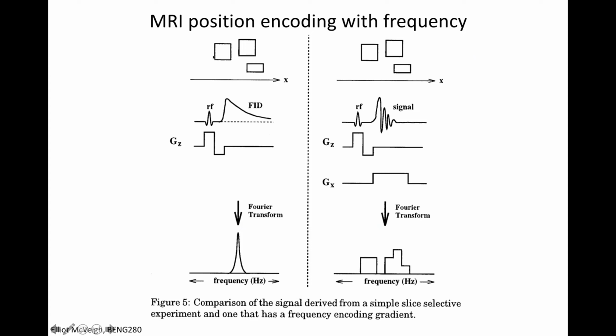And this is straight out of that little 20-page write-up for the Introduction to MRI for Engineers that's in the modules section. So you can go back and read the text in that if this isn't clear. But this is a simple object, right, in the plane, and this is the X direction. I apply a slice selective pulse, right, refocus the slice, and I get a signal.